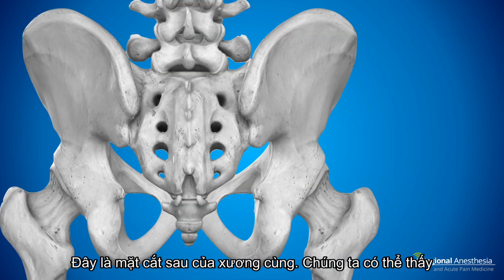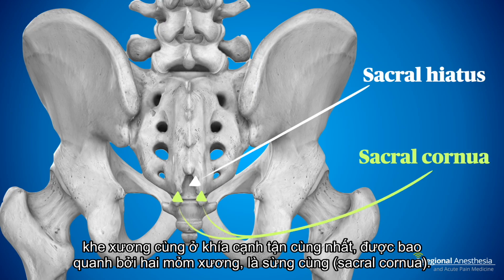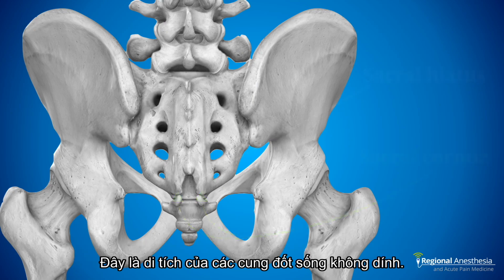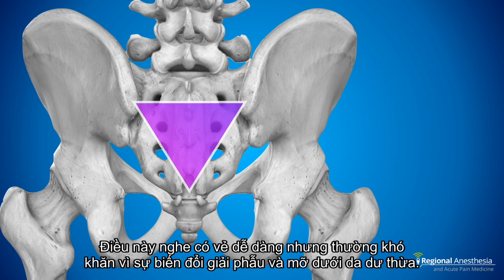Here's a posterior view of the sacrum. We can see the sacral hiatus at the most caudal aspect, flanked by 2 bony prominences, the sacral cornua. These are remnants of the unfused vertebral arches. In the landmark-based technique, we're taught to feel for the posterior superior iliac spines and imagine an equilateral triangle, with the apex giving us a location of the hiatus between the cornua. This sounds easy, but it's often challenging because of anatomic variation and excess subcutaneous fat.